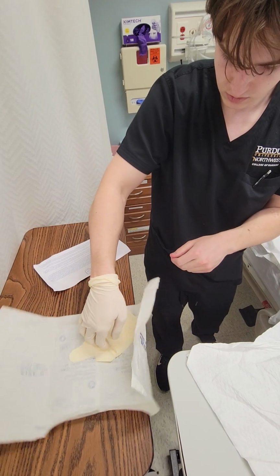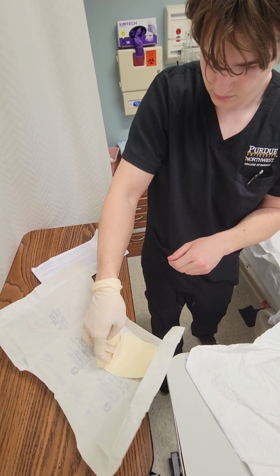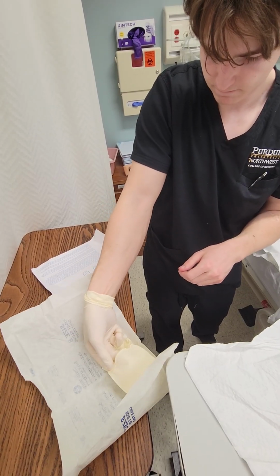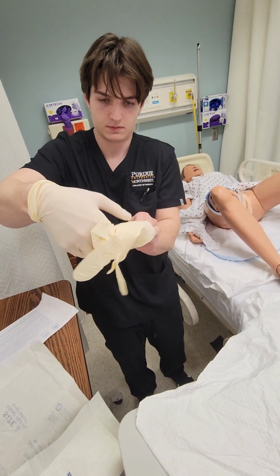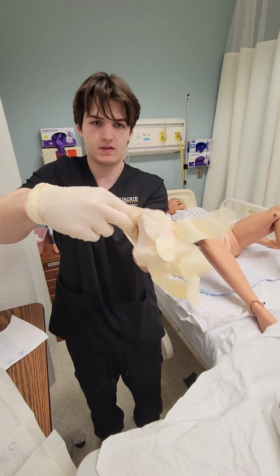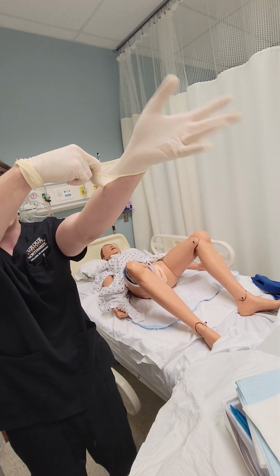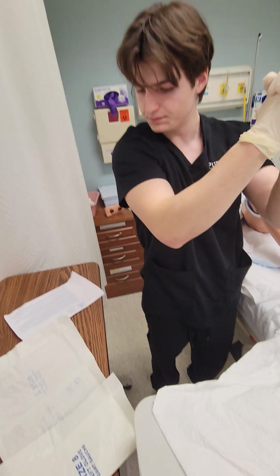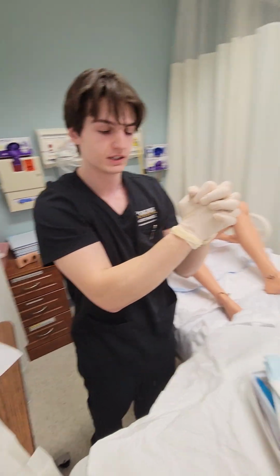As difficult as it's choosing to be. There we go. That's the wrong one. There we go. Alright, gloves are on. It's not getting in the way, so I'm not going to toss it quite yet, as to avoid accidentally breaking sterility.